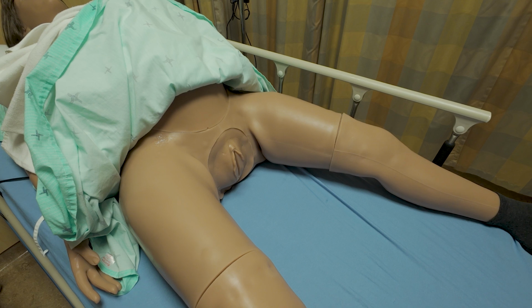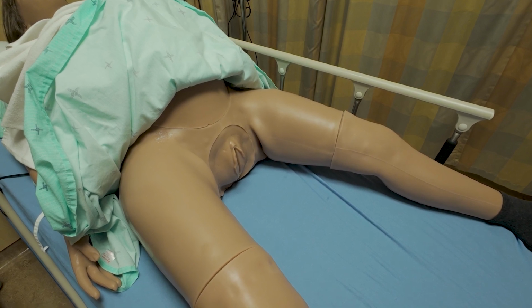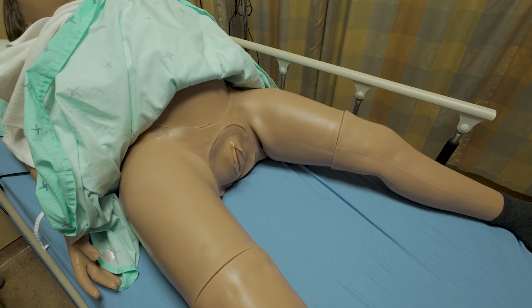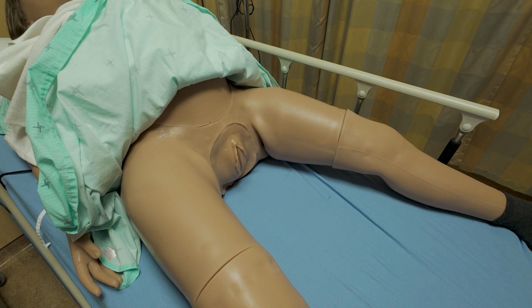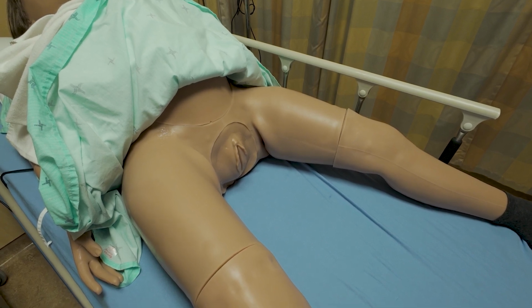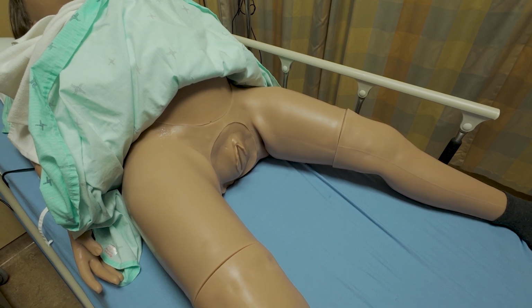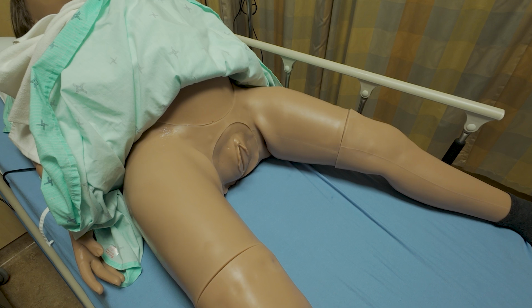There is always the risk that we may scratch the baby's head with our amni hook. And as always, there's the risk that we may accidentally cause trauma to our client's tissue or cervix. But we can reduce these risks by being gentle and doing a thorough assessment prior to proceeding with the AROM.